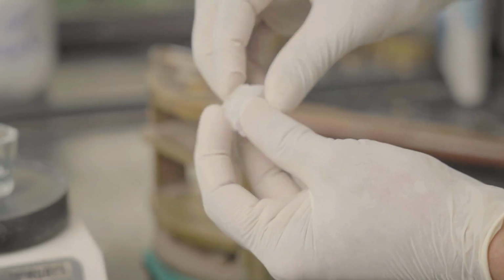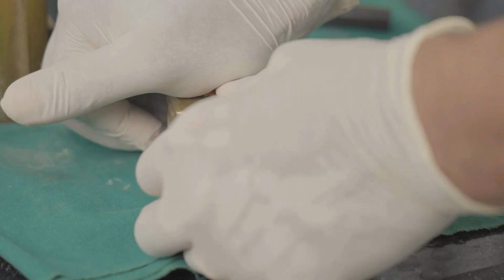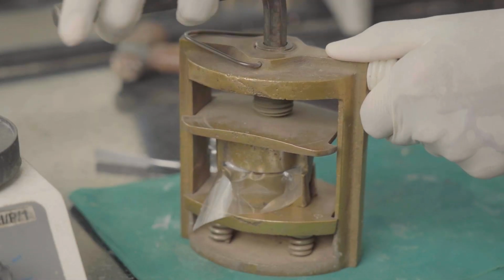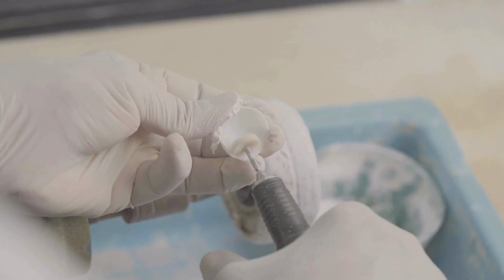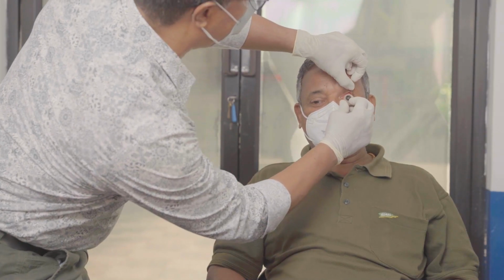Clear acrylic is prepared. Once the dough is formed, the clear plastic is placed in the plaster mold. This is cured for 1 hour in a 100 degrees centigrade water bath. Once the curing is done, the cast is removed. Then the shell is smoothened and polished. Now the artificial eye is ready for delivery.